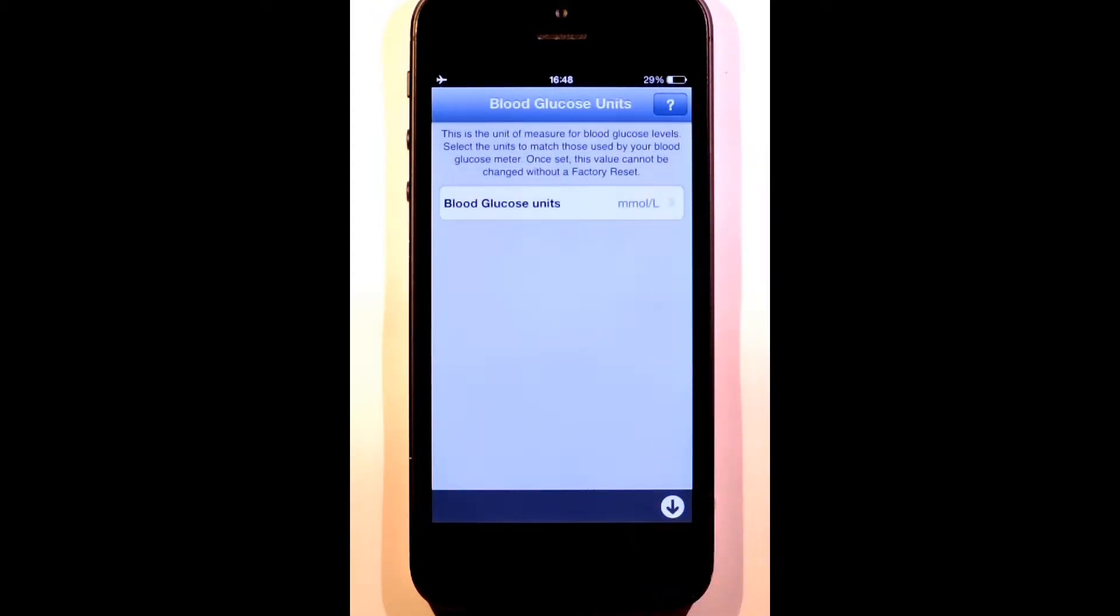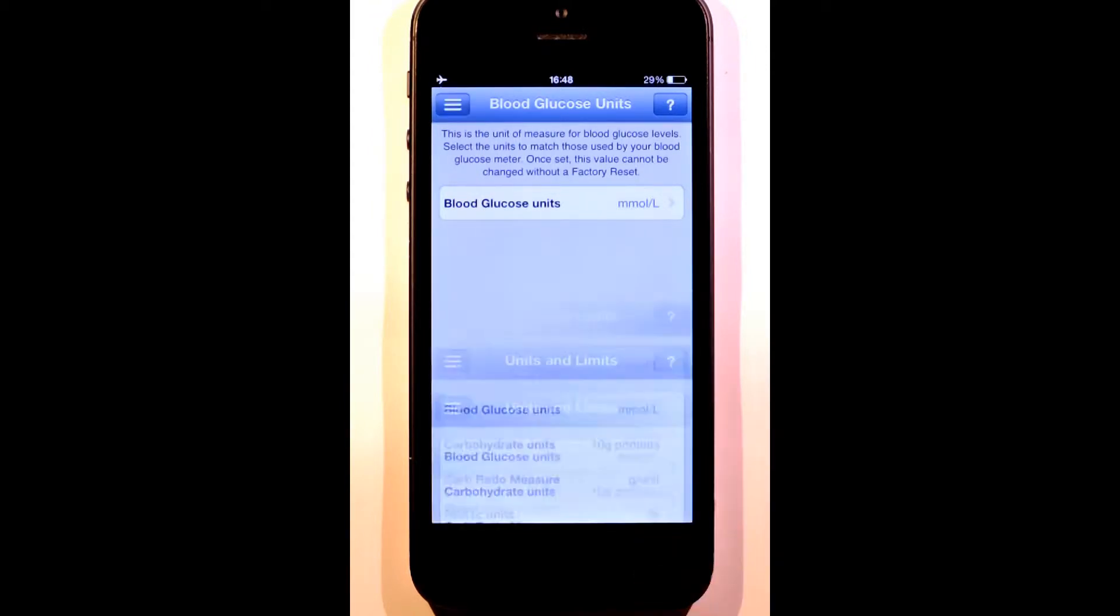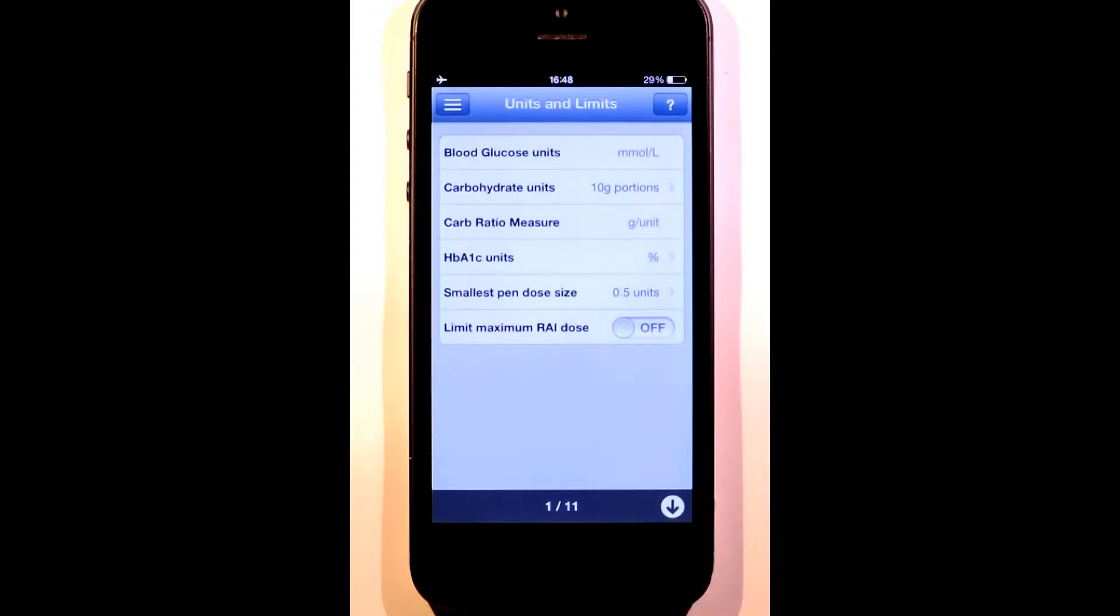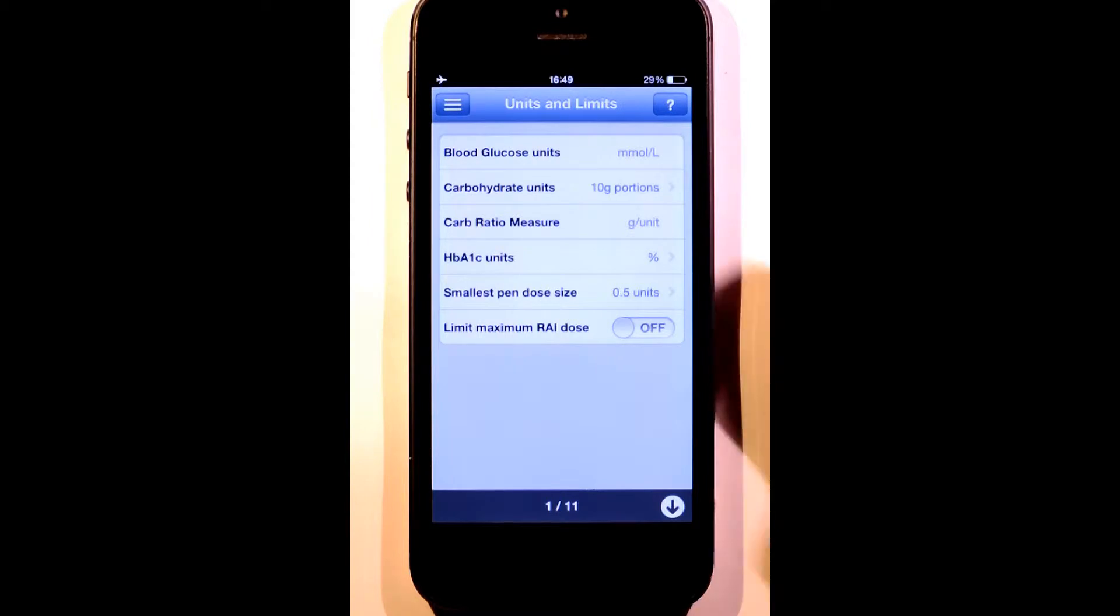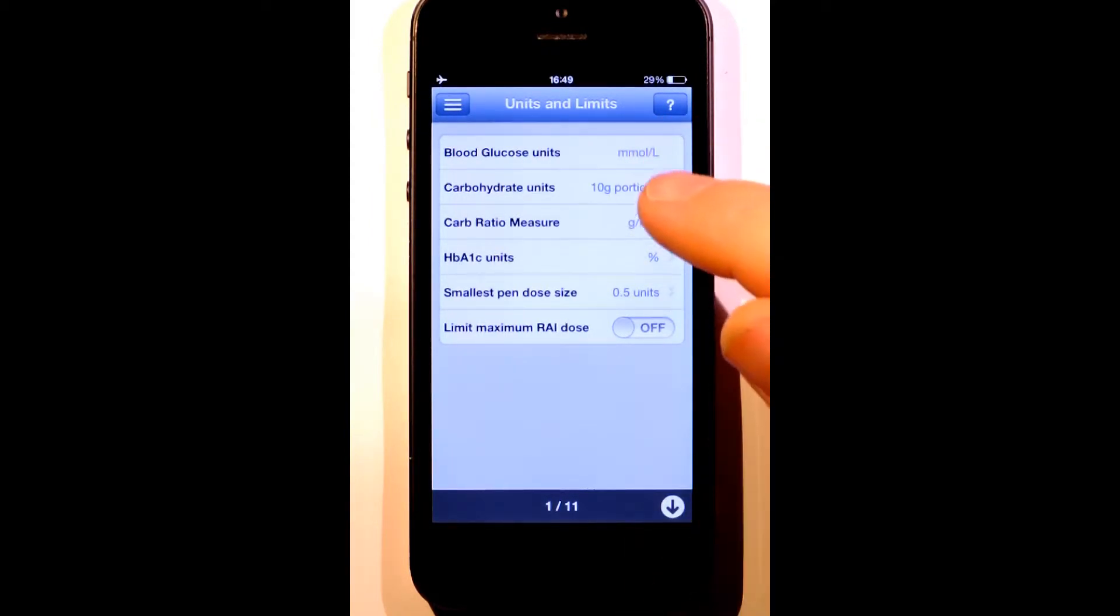Now we can start the rest of the configuration. The settings are divided into a number of sections. This first section is where we enter our units and limits. Our blood glucose units are already set. The next choice is our carb units.